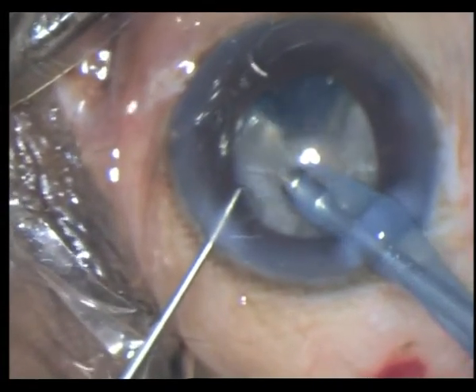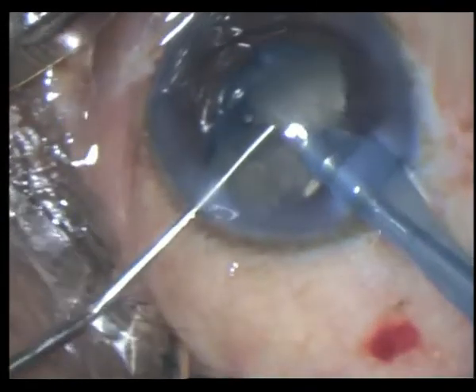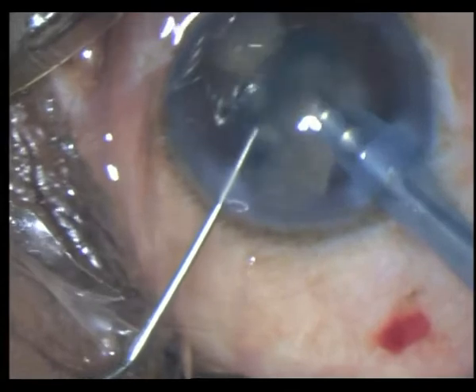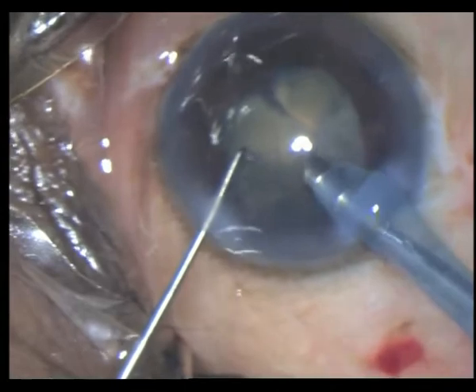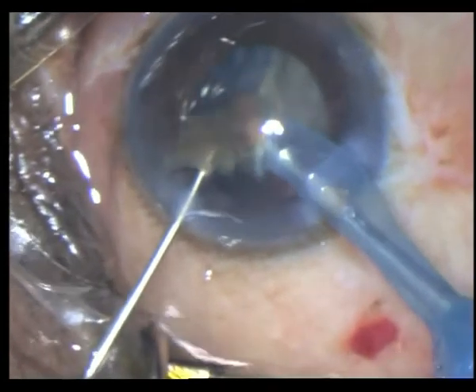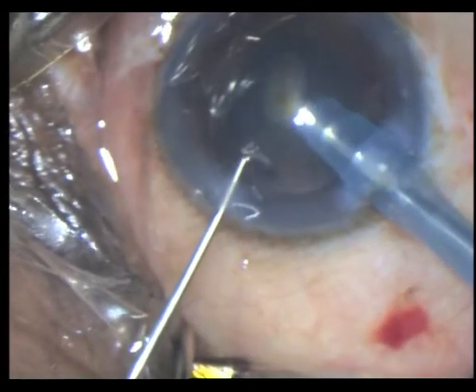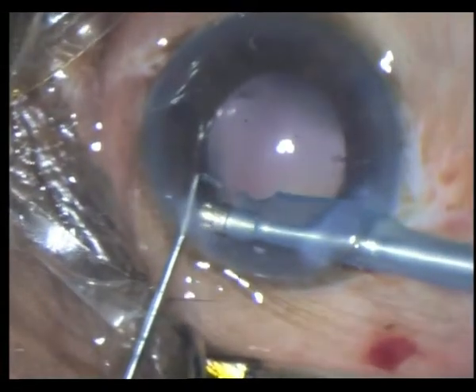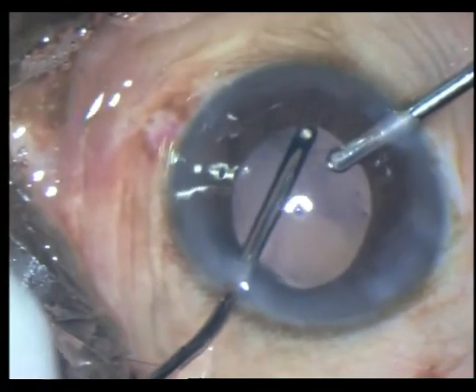Even though the fragment is large, you can chop as you bring out the large piece. Try not to have too many fragments in the anterior chamber — just emulsify them so that they don't start kicking against the endothelium. My vacuum is around 400, my aspiration rate is around 40 ml, and I am at 80% power using continuous phaco for the emulsification.